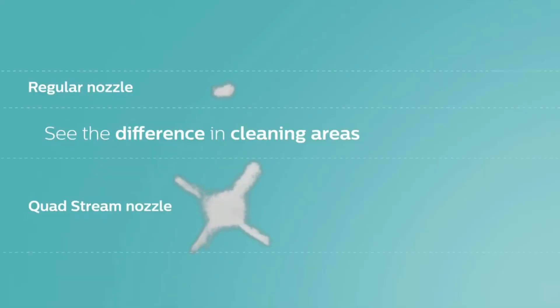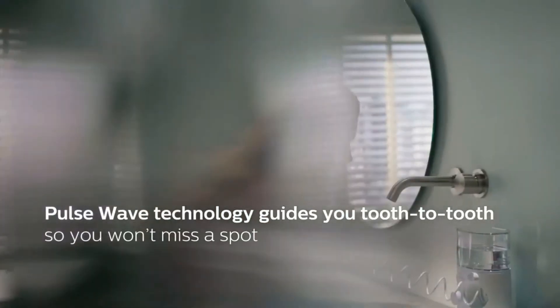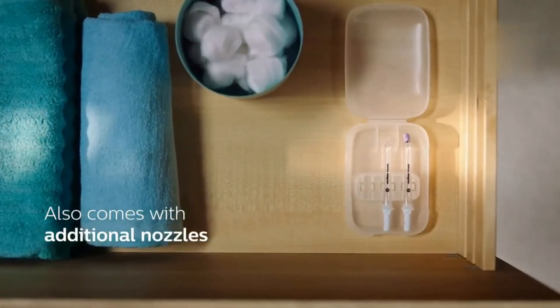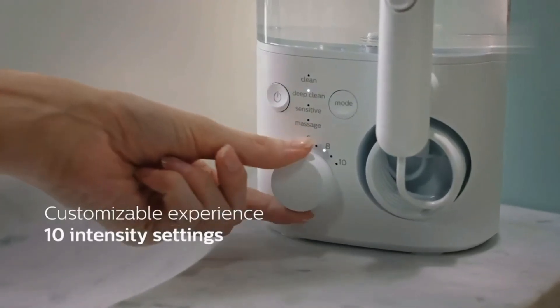Its 4 water stream settings — clean, deep clean, sensitive, and massage — plus an auto-timer let you reach thoroughly into gum lines. One tester said: with my old flosser, I think I moved too fast between my teeth to do an effective job. I feel like I have completely relearned the correct way to use a water flosser.